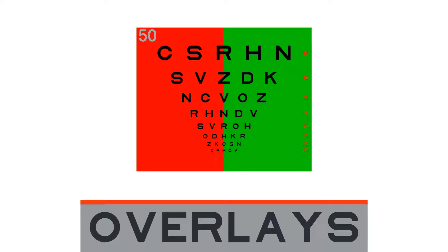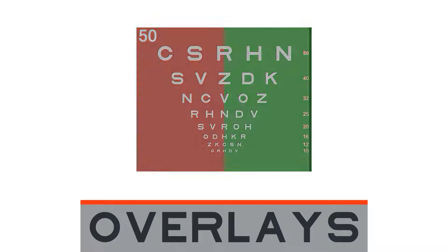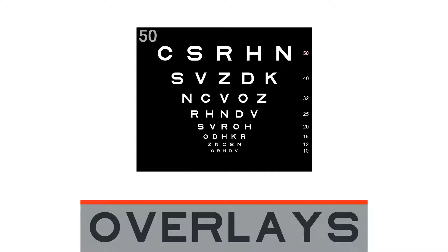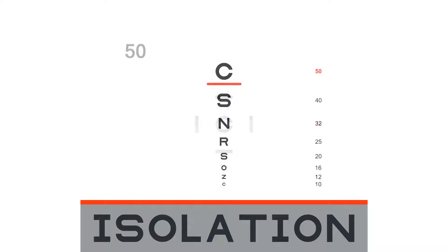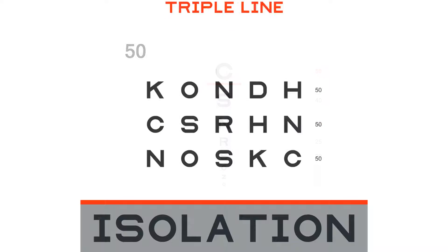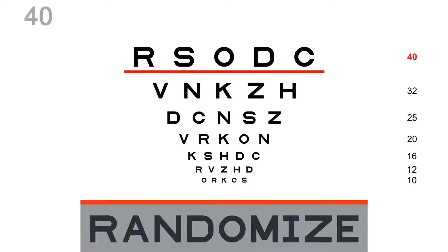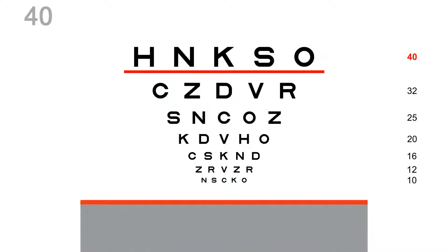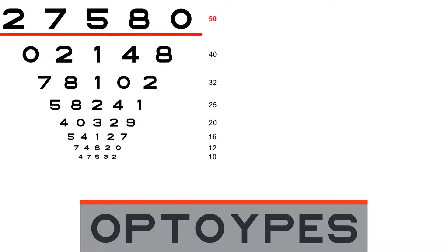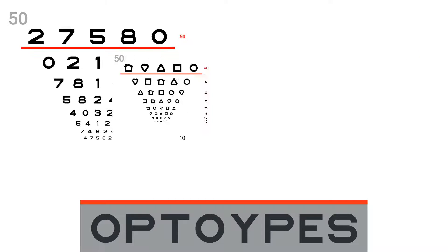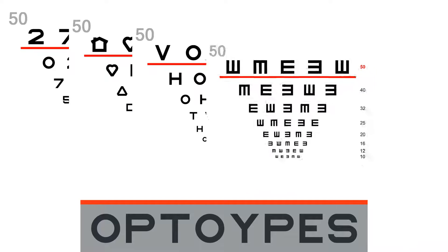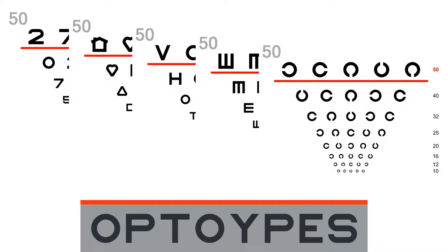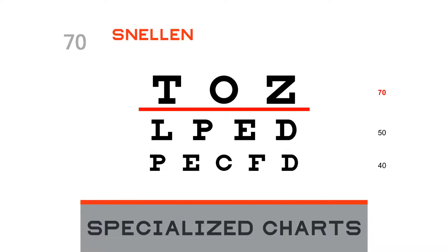The chart has overlays, can isolate letters, and randomize the letters. Choose from many optotypes, including Sloan compliant, numbers, pediatric, HOTV, E's, and C's, and specialized charts.